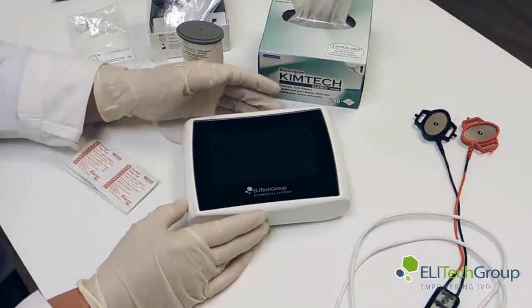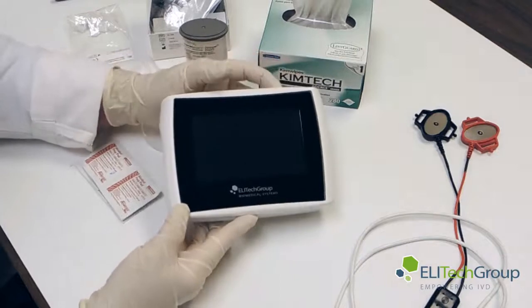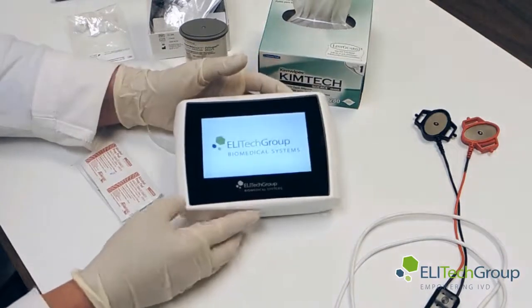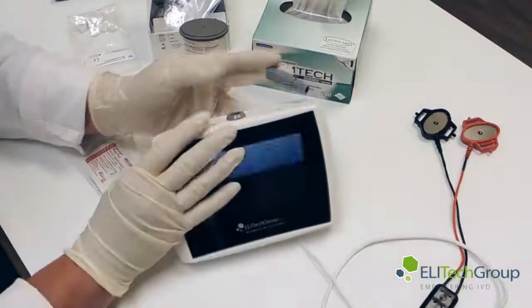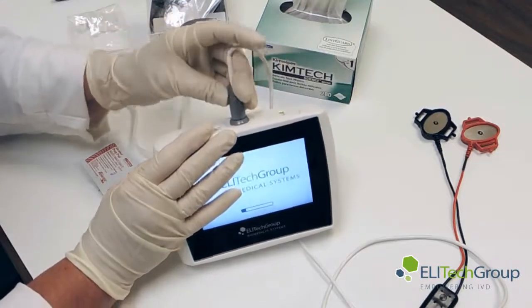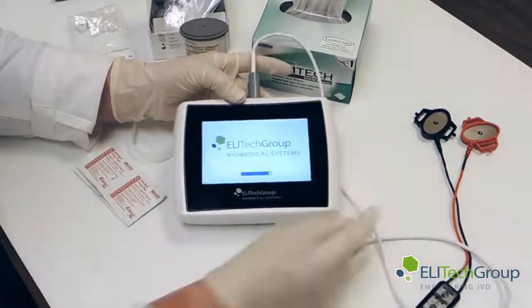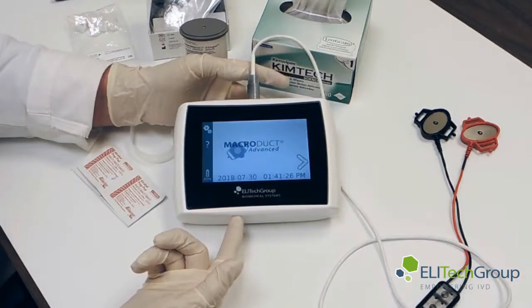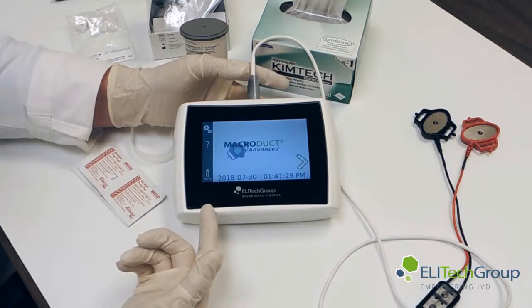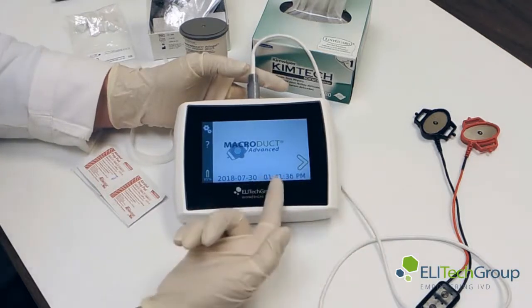We'll be demonstrating a sweat test using the 3710 MacroDuct Advanced System. First, we need to turn it on and power it up. The screen comes on. Now we'll put in the cables — it self-aligns and clicks in, and ensure that you have a good connection. While it's powering up, it tells us and as we go through the screens, it will show us step by step what we need to do. You can see we have the MacroDuct Advanced System with the date and time.